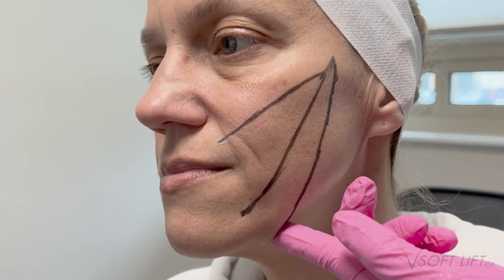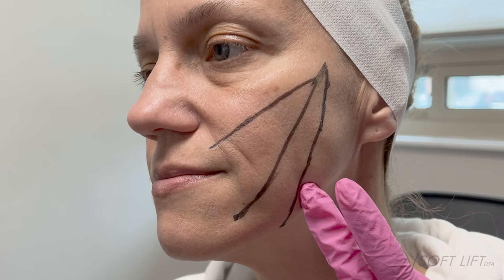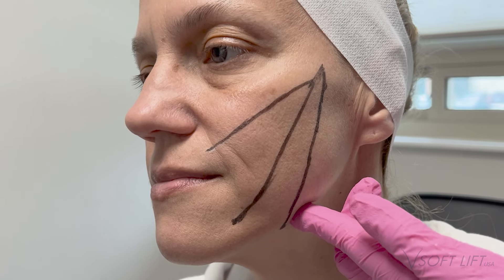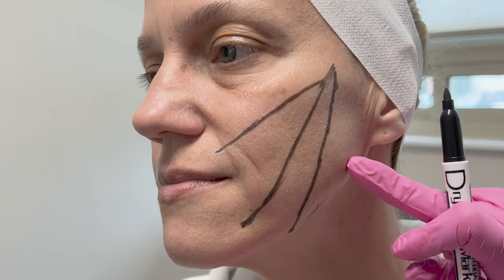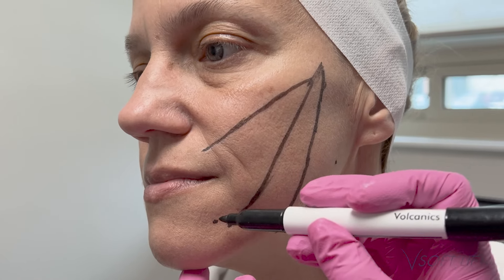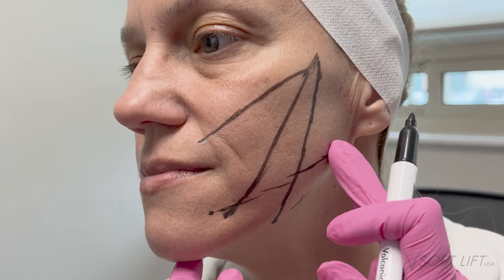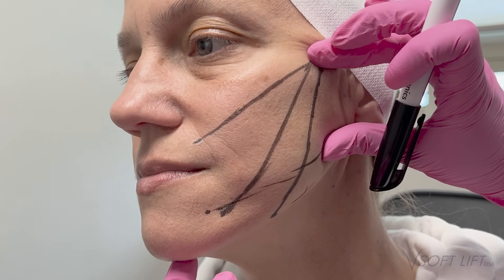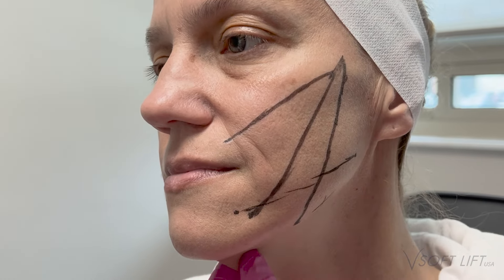I'm pinching just that little bit of jowl tissue — she doesn't have jowling yet, but this is where she will eventually develop it as the aging process continues. Here I'm feeling for my angular notch. With lifting threads there is no risk of vascular occlusion, but I do like to avoid the angular notch area due to the facial artery. Worst case scenario, the patient gets a hematoma, so we're trying to avoid that. I'm just marking it so I have a visual reference once the patient is laid back.